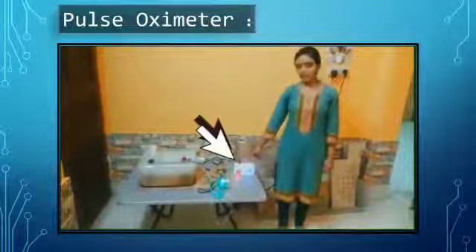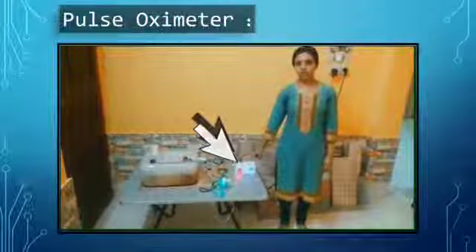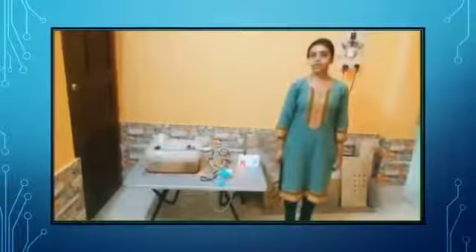Coming to our second device, this is a DIY controller based pulse oximeter. Now, let's have a demonstration of our kit, the pulse oximeter.